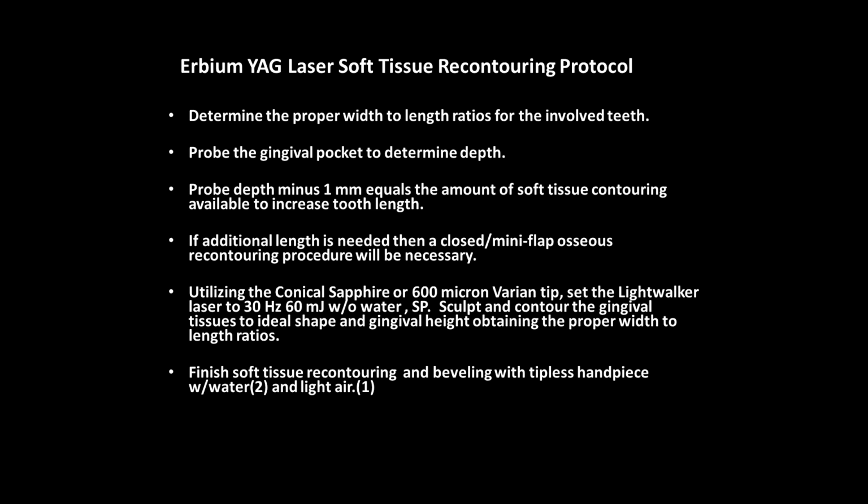and then we're going to use light air. And the reason we want to finish with water is that what we leave the patient with is what their post-op sensitivity is going to be. So if we do our last little bit of recontouring with water, the zone of necrosis is so minimal compared to any other treatments out there, even diodes and Nd:YAG, that patients don't have post-op sensitivity with this at all. They don't have to take anything, not even OTC type medications.